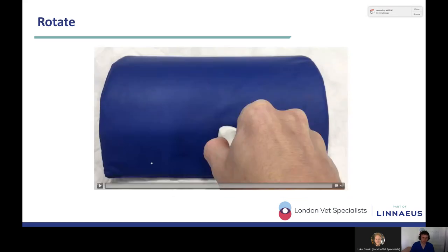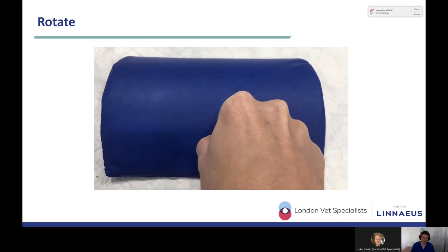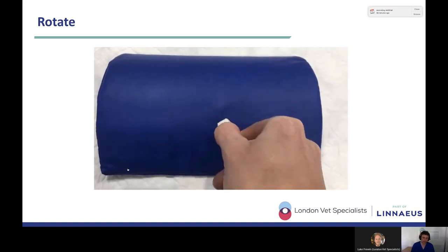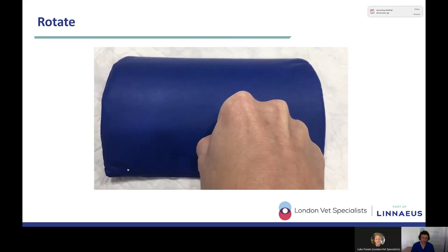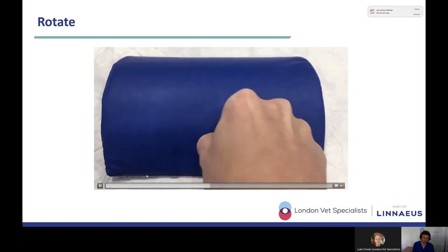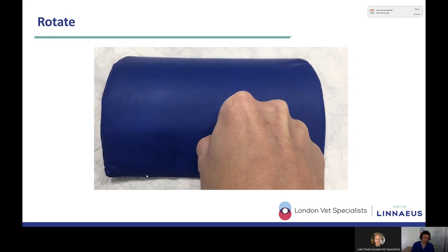The next one is rotate. So here the probe position isn't moving, so there's no slide. What we're doing is we're using our wrist to rotate that probe 90 degrees. So the probe is in a fixed position. You fix whatever structure it is that you're interested in within your sector, and you are rotating your probe, usually to change the orientation of the view that you're interested in. So for example, to go from a long axis view, either a sagittal or a dorsal view of a kidney, to a short axis view. But it's important to note that the position of the probe on the patient doesn't change. You're not moving it cranially, you're not moving it caudally, dorsally or ventrally. The probe is fixed, you're just moving your wrist and you're rotating.